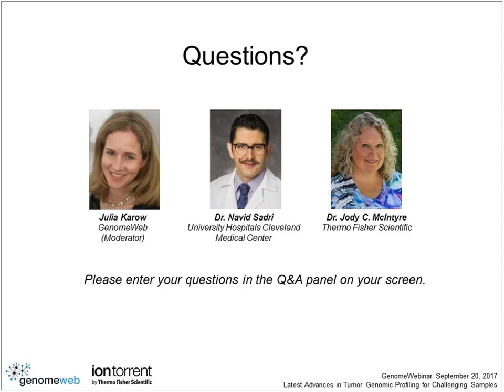Okay, thanks. And another question for you, Dr. Sadri. How do you see testing needs evolve as more lung cancer markers are being discovered and connected to therapies and clinical trials? And do you have any plans to expand beyond the current gene panel on the Oncomine Focus assay? Yes, that's a very good question. I think things are always evolving. We are currently in the process of expanding upon the Oncomine Focus assay. We've gone in and designed our own amplicons on top of the assay. For people who want something more out of the box, there are some of the bigger panels, such as the same panel that's being used for NCI Match, the Oncomine Comprehensive Panel, that could be used. But I think the ease of the Ion Torrent system is that you can very easily build upon the assay to keep up with the changing system.